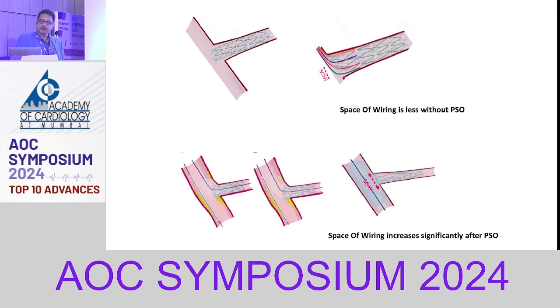And this is what happens when you optimize the ostial stent deployment. This can happen with a compliant balloon or a non-compliant balloon. And this is how it looks when you crush with the balloon. There is full contact at the ostium. So this is a step that has been introduced in the last couple of years. This we were actually practicing much earlier, but we didn't present this. In fact, we presented this in the EBC of 2017, but we didn't think that this is really worth mentioning as a separate paper. So I think we missed it.